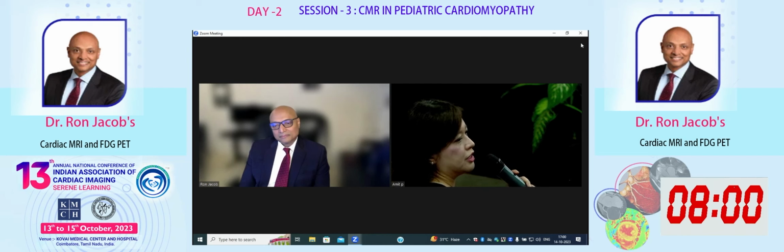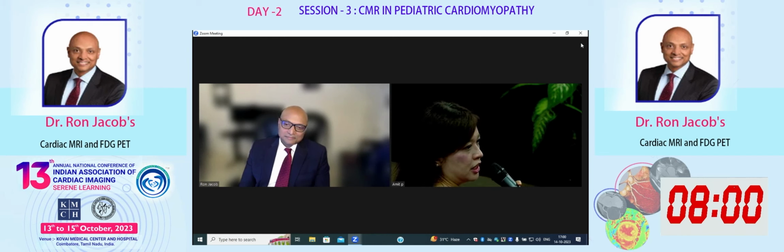So if I were to give my method to you, Dr. Nuri, and I send a phantom to you and check that it works well on your scanner, it is hoped that you can just use my healthy volunteers as a reference range. You don't need to scan 100 yourself because your method is working the same way as my method. And that would be really good for many centers, because a lot of centers cannot scan so many healthy volunteers all the time.